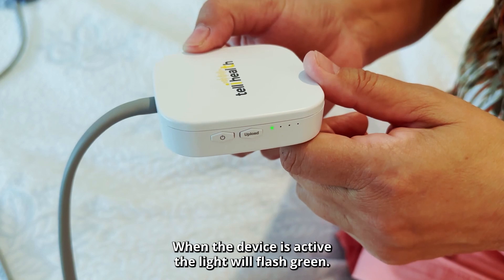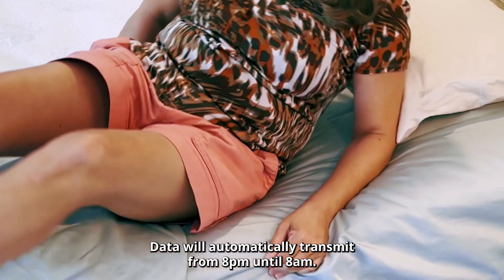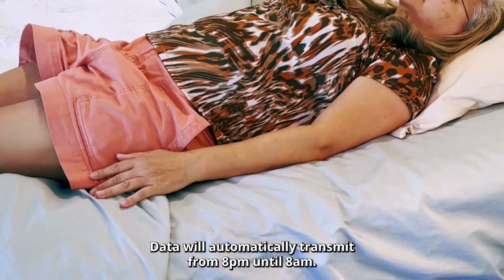When the device is active, the light will flash green. This will only happen after 8 PM. Data will automatically transmit from 8 PM until 8 AM.